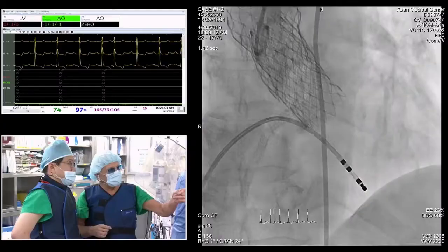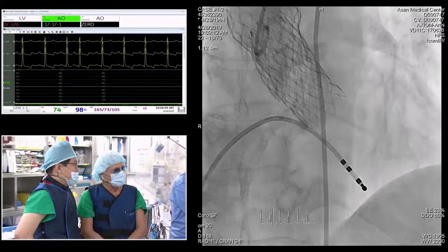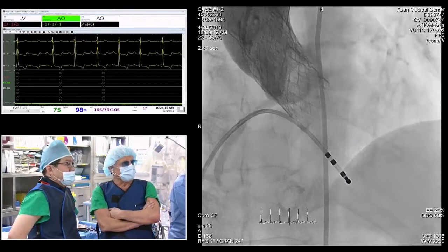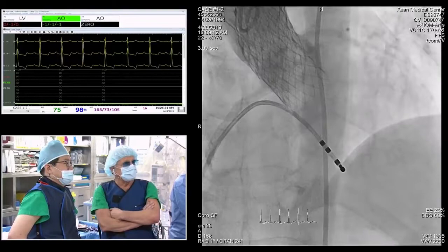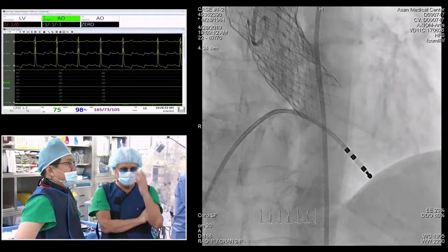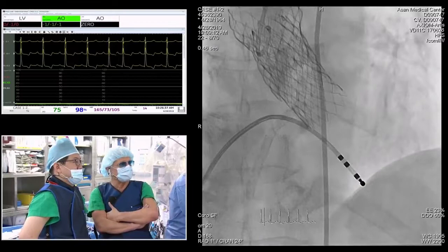Yeah, so as you can see here, I don't know which image you can see, but the second one was fairly stable, also the depth. Here you can see the depth is in the range of 4 or 5, and it's sealed very nicely. It was unexpectedly challenging, to be honest. We didn't expect that. We don't want to say, well, this is what life is, but sometimes it is what life is. For you guys sitting there, it's always better to sit there than standing here. But I hope we got the case done for the patient okay.